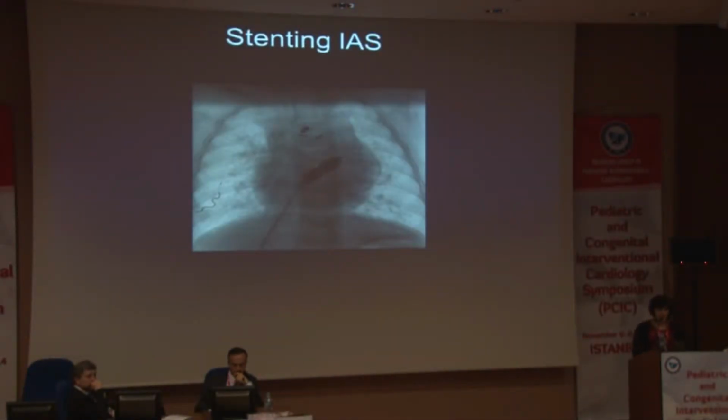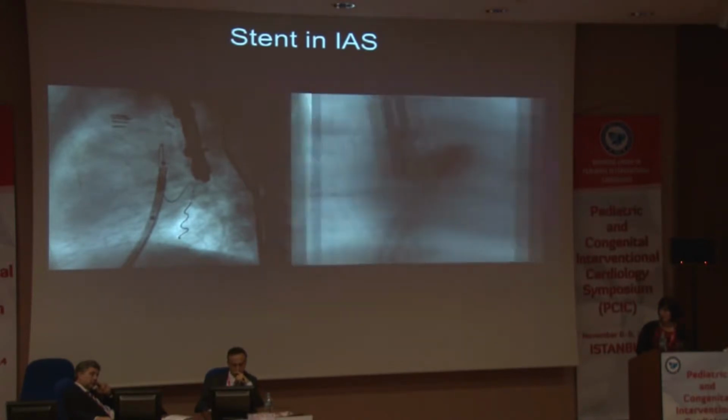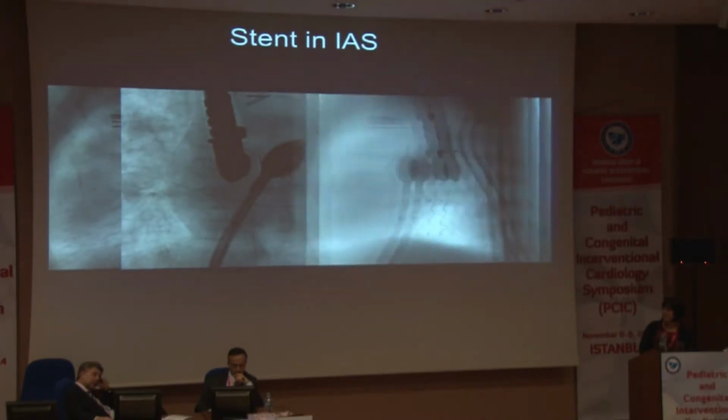In this patient, it was in the setting of a univentricular heart where the ASD had become restrictive, and due to bilateral femoral venous occlusion and post-Glenn shunting, a transhepatic route had to be taken because intra-atrial stenting was necessary. So here you can see the stent in position. Again, here one must be careful not to lose your sheath position. Obviously here you've got your long sheath, and we opened up a stent with sequential stent opening.